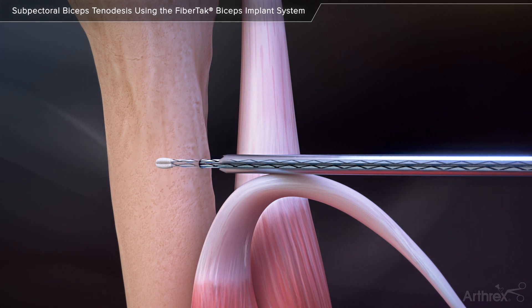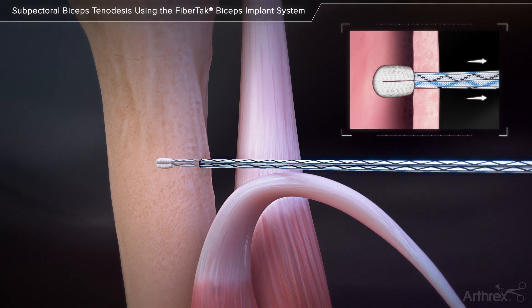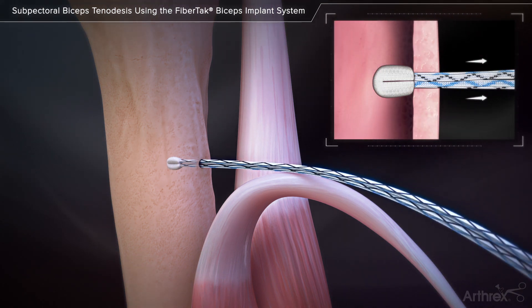The drill guide slot will allow the sutures to become free from the guide, and the guide is removed. Pull back on the sutures with a slow, continuous pull to set the implant.